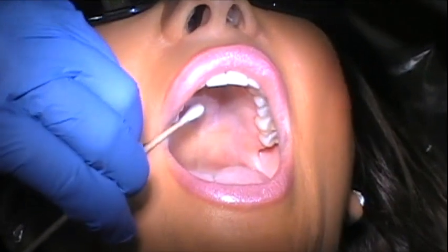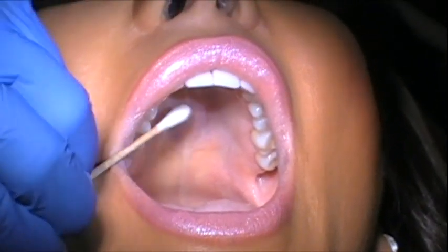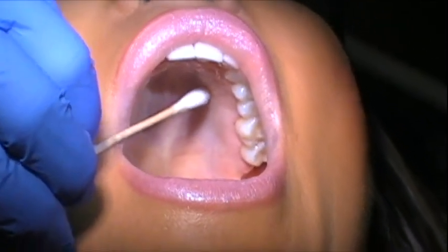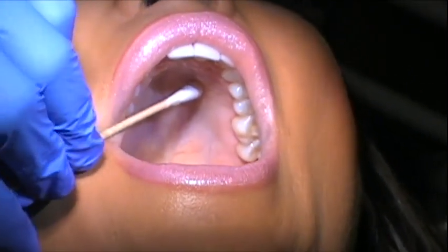I'm going to demonstrate the AMSA injection. The landmarks for this injection are the premolars and the midline. You want to go about halfway between the pre-gingival margin and the very middle of the palate, kind of where the horizontal and vertical planes meet. Then feel around until you find a nice springy spot — right here feels nice and springy, so that is going to be my site.